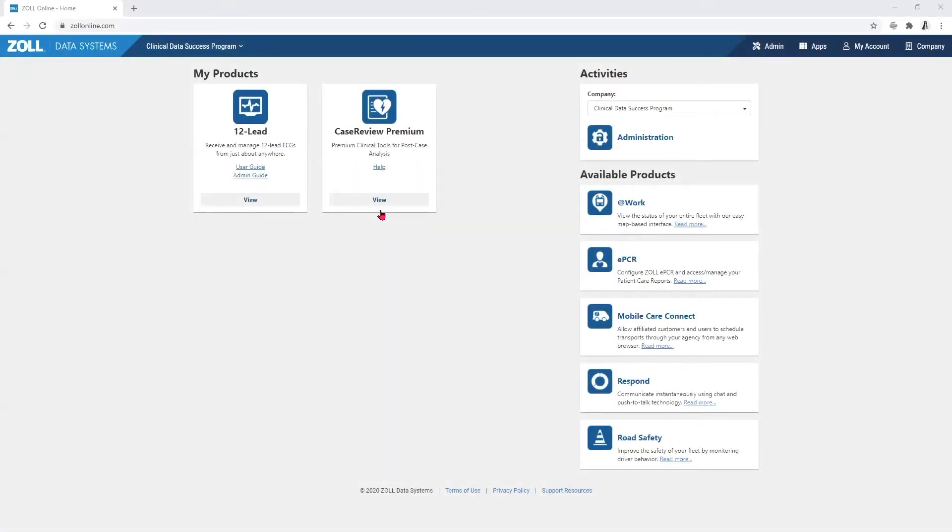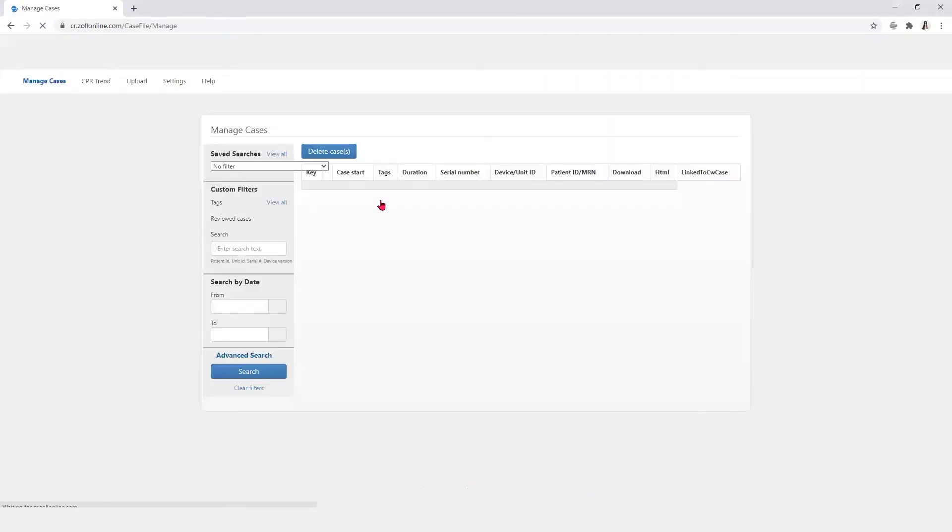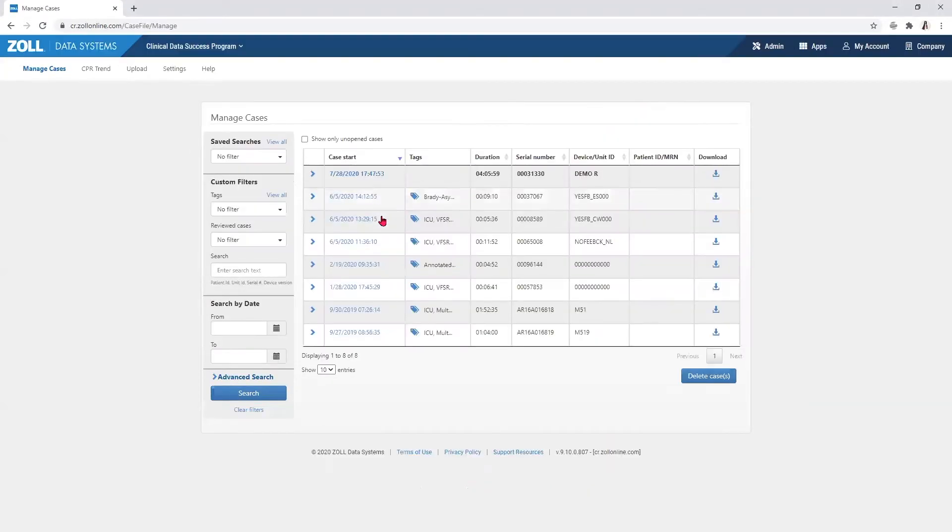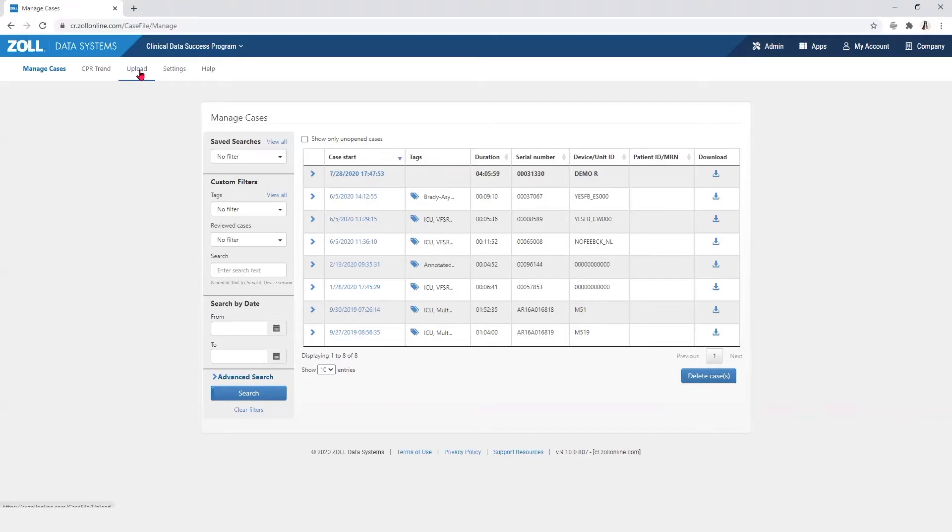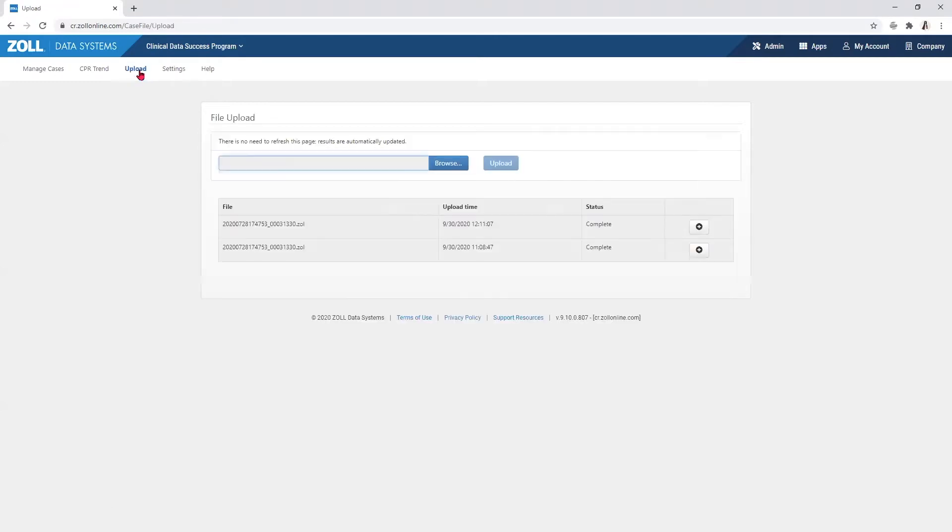The Manage Cases page is displayed when case review is open and includes all of the cases that have been uploaded from a device. Cases are pushed either automatically or manually from the device or can be uploaded from the upload page using the file upload feature.